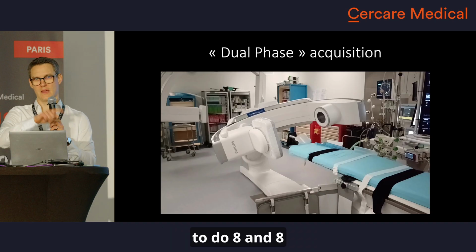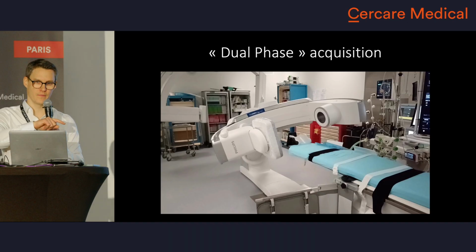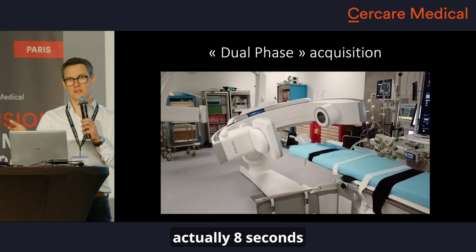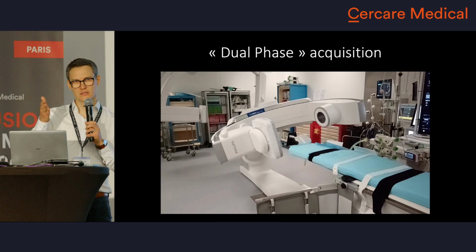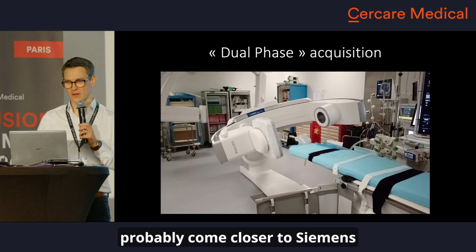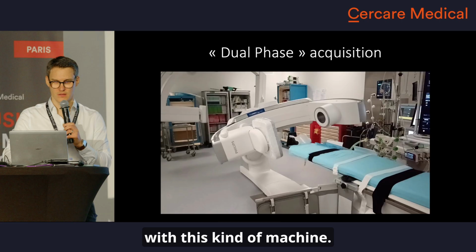Actually, we are able to do 8 and 8 with the butterfly. And with this, it's a scan that is actually 8 seconds that you can decrease up to 6. And now we will probably come closer to Siemens with this kind of machine.